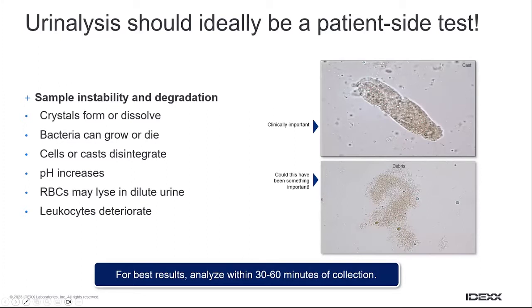Clearly sending it to the lab may be something that you have to do for a variety of different parameters. But if you have the facilities in-house, a microscope or whatever to do a sediment examination, it really is encouraged that you do that patient side, because within a very short space of time, we can get a lot of changes which can impact our analysis of the urine sample.